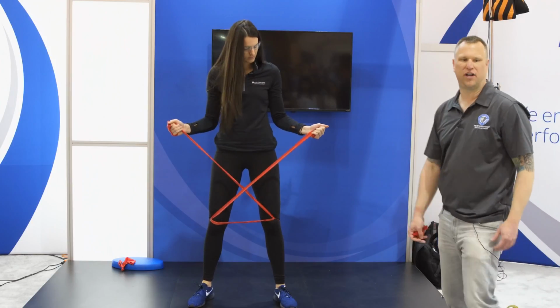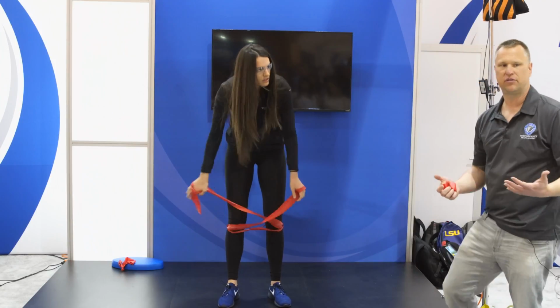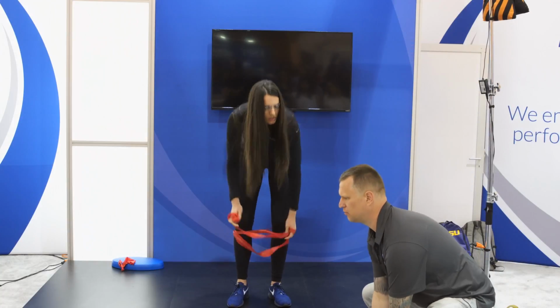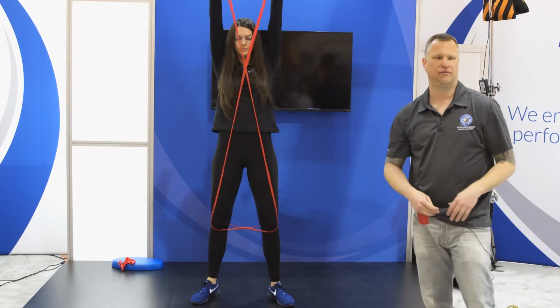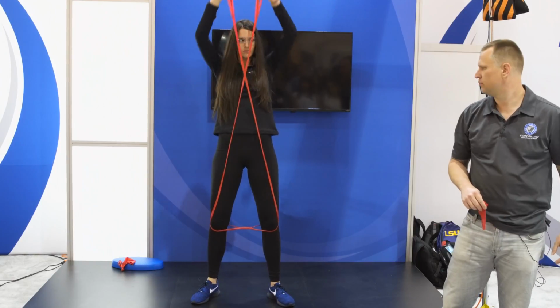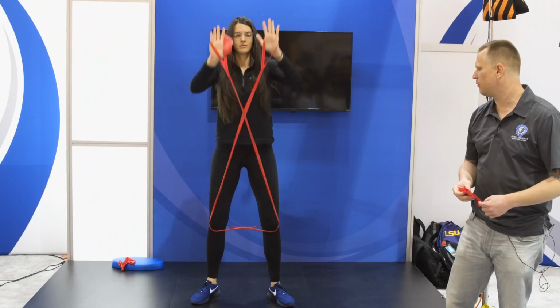Okay, what if we wanted to go overhead? What if we wanted to go from a squat position all the way into an elevated stand position? We can do that with the CLX. So let's go again. We're gonna go down, we're gonna lift something, take something off the floor, we're gonna go all the way up and raise it up over the head. Down to the floor. So the idea of getting into functional activities. Okay? Much more challenging to do with the traditional flat band. CLX gives us a lot of advantages in that regard.